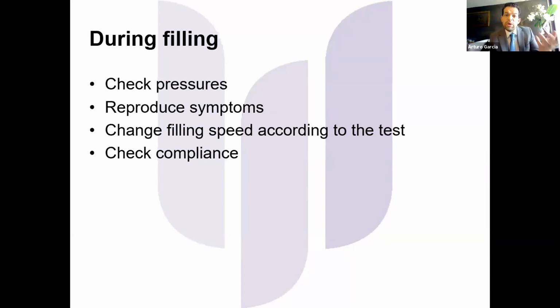We didn't find what we were thinking we were going to find. We actually find the detrusor overactivity incontinence, but the patient coughed and then she leaked. So we reproduce the patient's symptom. This is very important for us to look for the symptoms with the patient.